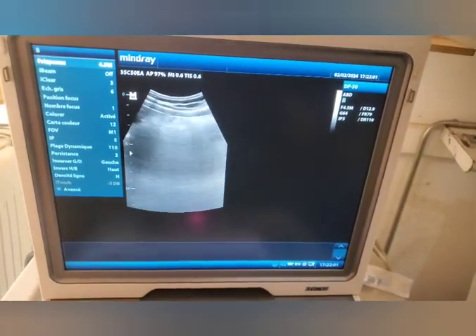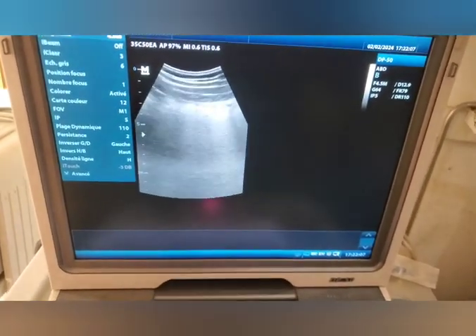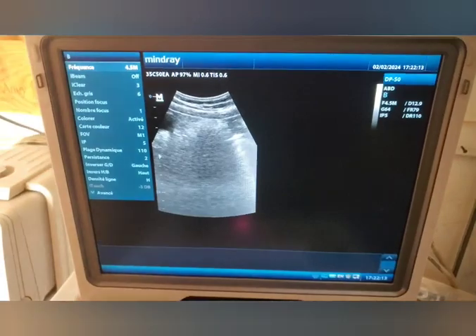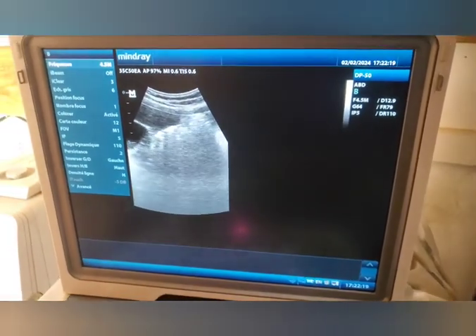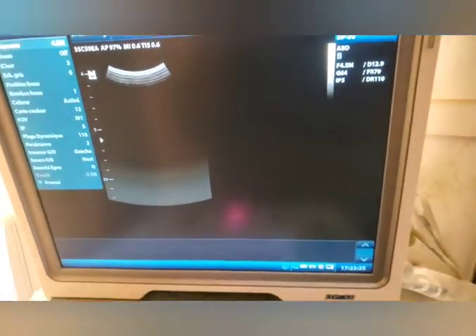So when you do it like that, I place it at the level of the abdomen, I can visualize the gallbladder. And the best way to visualize a structure in the body is to inspire. When you inspire, you see the structure is well visible. Is it clear? And then you expire. So let me just take the image and show you.